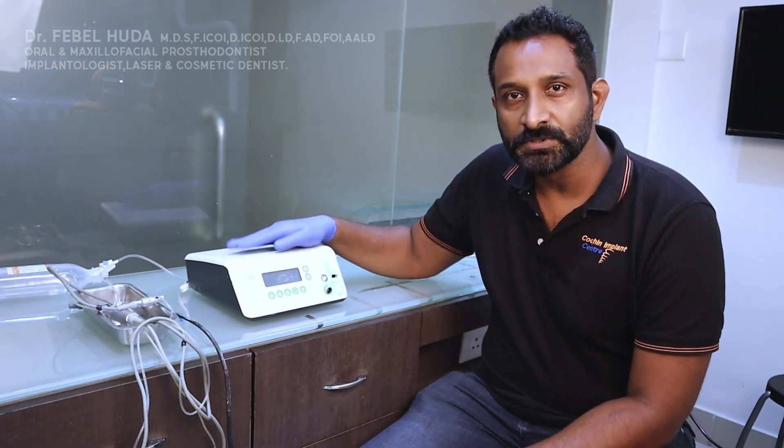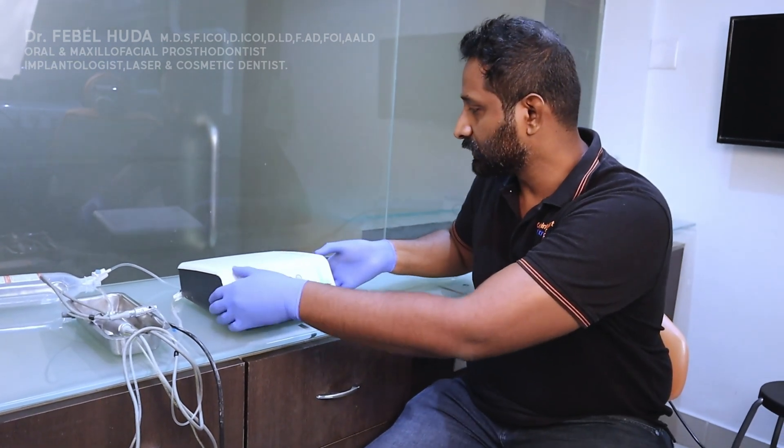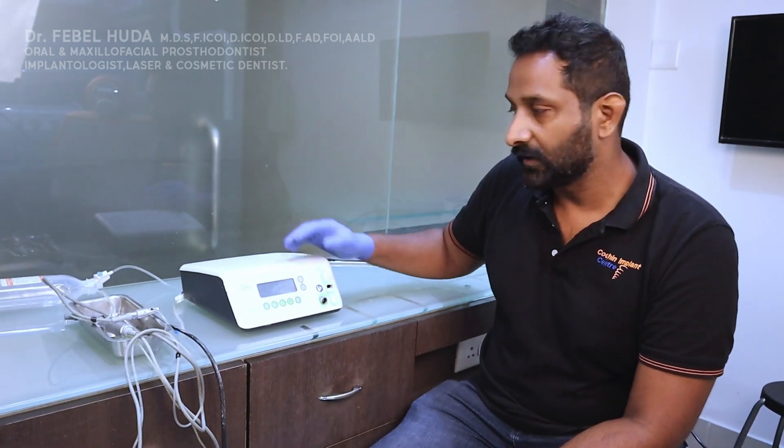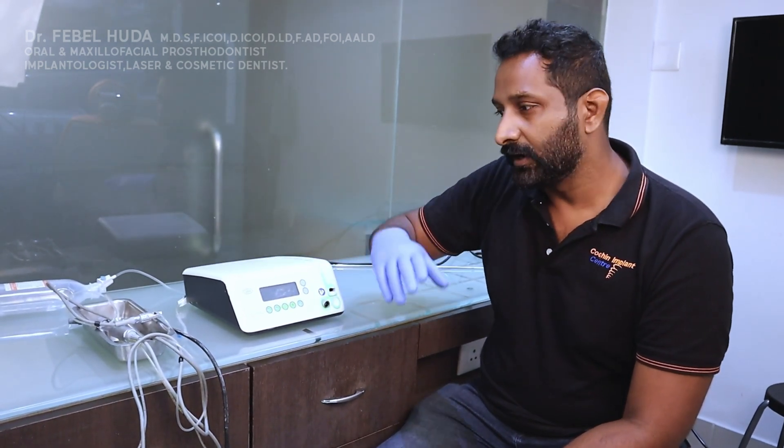Today we are going to see how to use a physio dispenser. I have a physio dispenser here and I'm going to show you all the components and how to connect them first. Once the connections are done, we will go ahead and see how it is used.